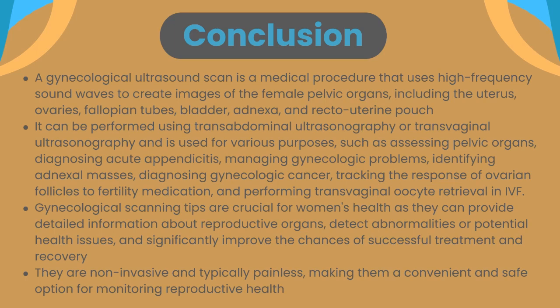Gynecological scanning tips are crucial for women's health as they can provide detailed information about reproductive organs, detect abnormalities or potential health issues, and significantly improve the chances of successful treatment and recovery. They are non-invasive and typically painless, making them a convenient and safe option for monitoring reproductive health.